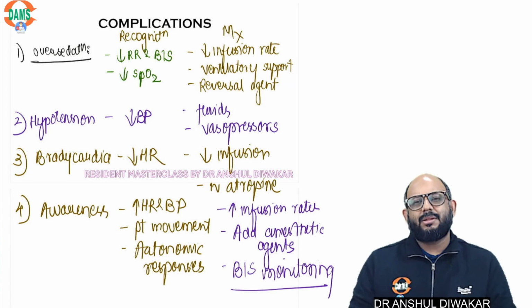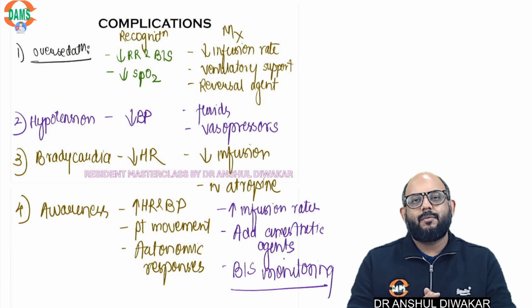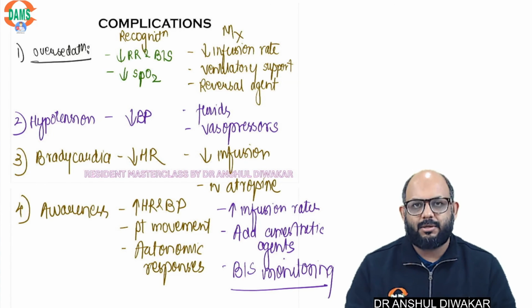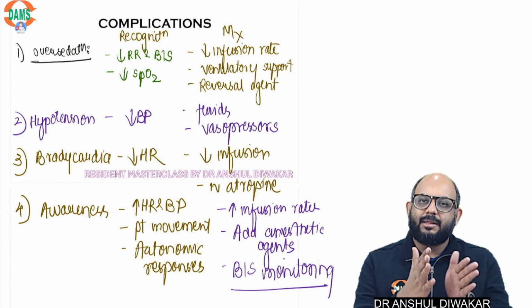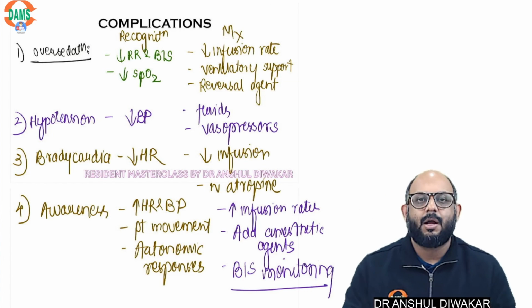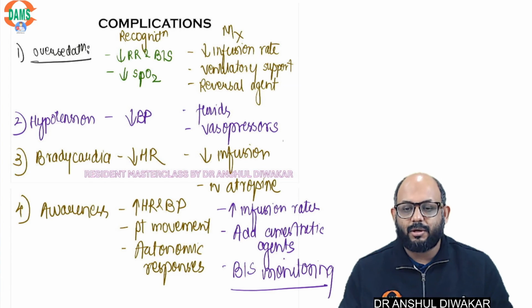Now there is a small thing that I want to tell you, that there is always a difference between what you deliver and what is actually present in the patient. So we tend to always think that what we have calculated and what we are giving is what the patient will achieve. But that is not always so. It doesn't really always happen that way.